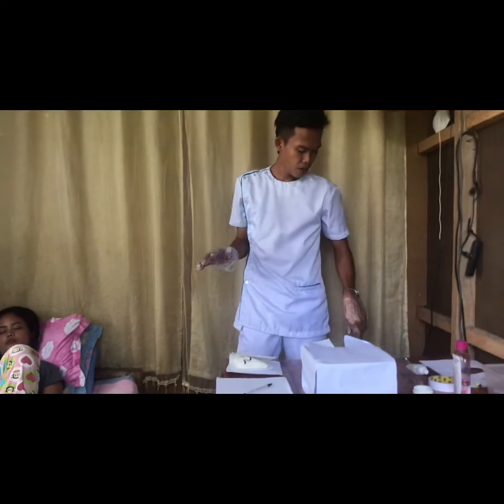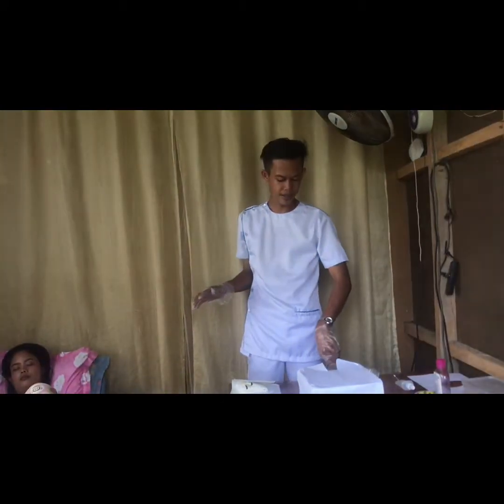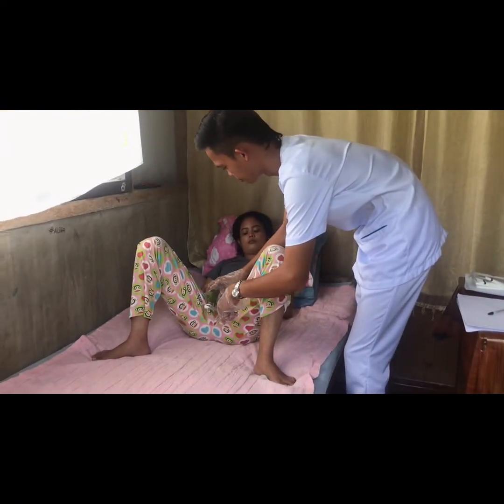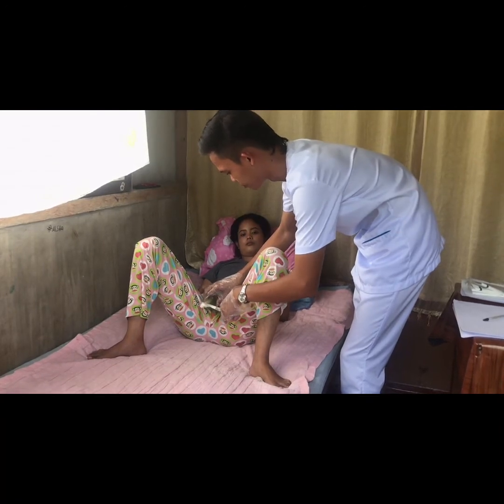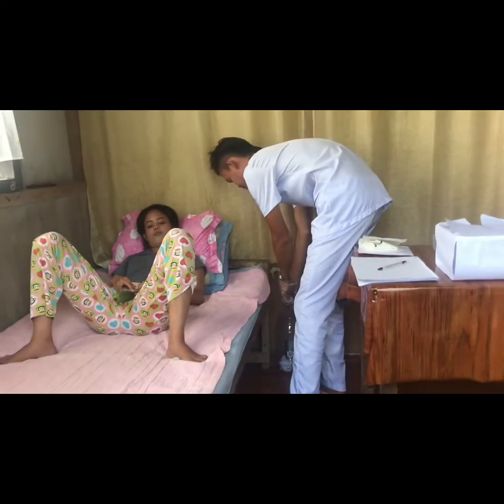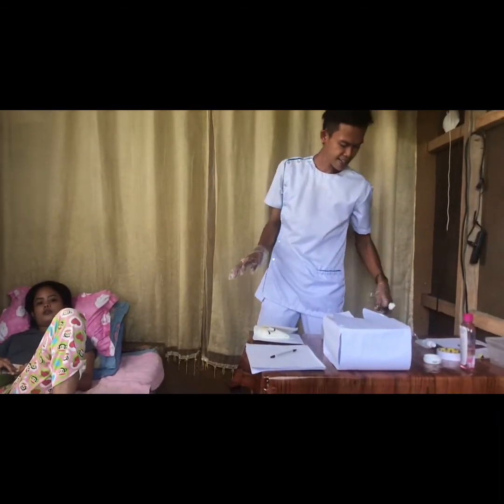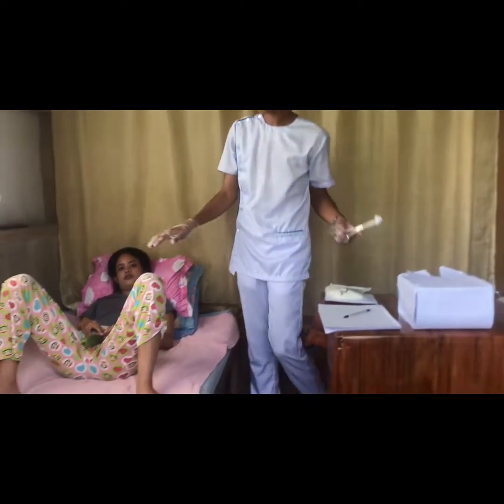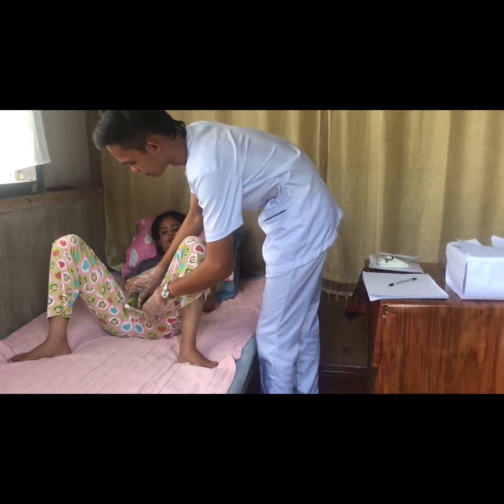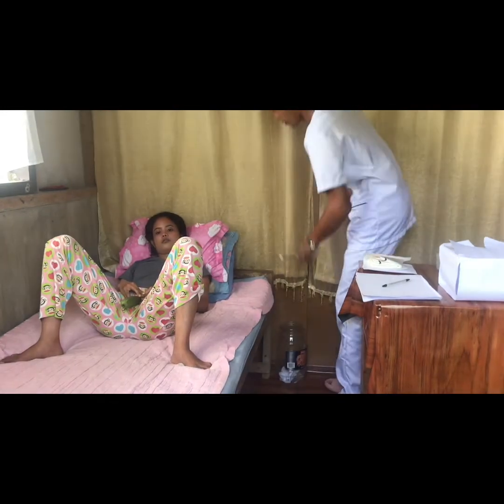So for the second time, we're going to do the same. Take the cotton ball, soak it with disinfectant solution, and clean the penis of the patient. Are you okay, sir? Yes. How's it going? I'm fine. Okay. So for the last cotton ball, we're going to do the same. I'm going to dispose of this.